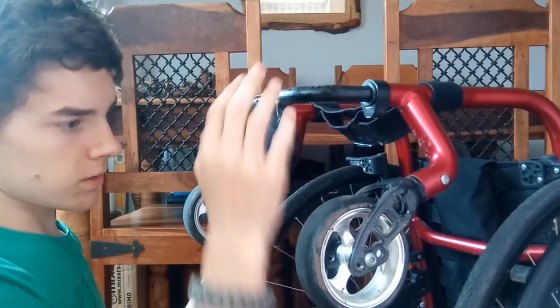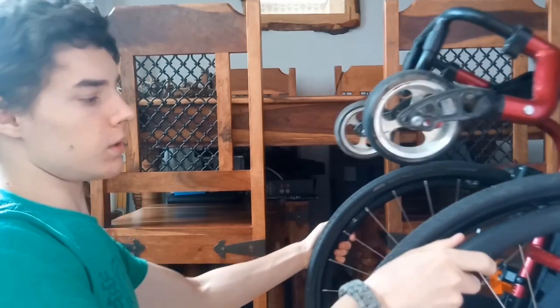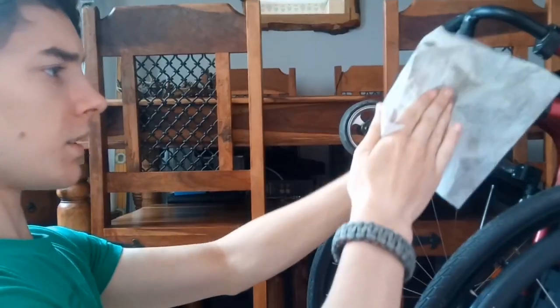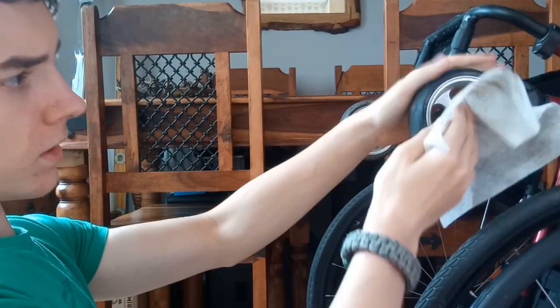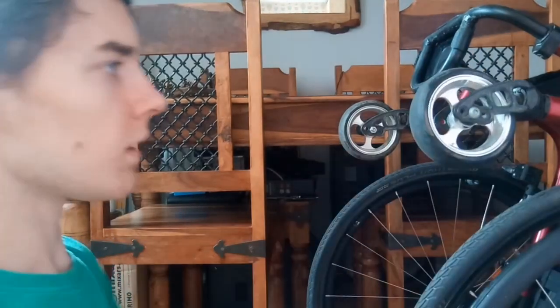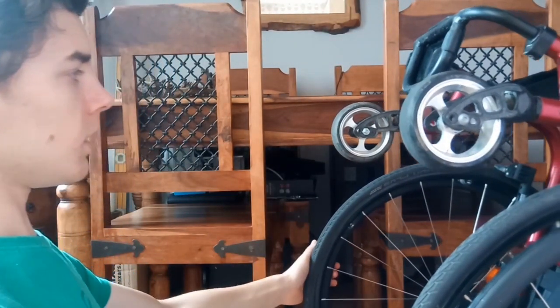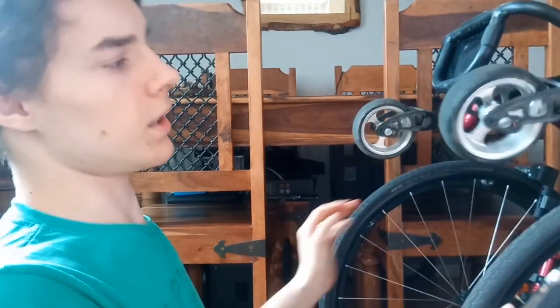Now for the casters, we gotta make sure that they are clean, and this is also what you would do if you needed to re-oil them. I don't think I need to re-oil them, but it does make it easier for the cleaning. So yeah, I'll just take them off real quick. So what I'm going to need is my spanner, and I'm going to show you from the outside actually.